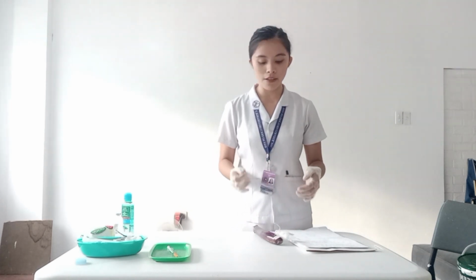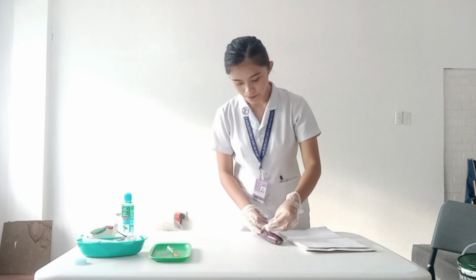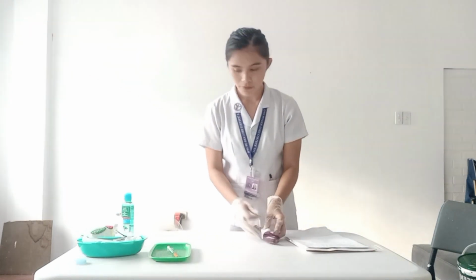So now apply gentle pressure at the site with a dry cotton ball. The use of alcohol swabs may cause pain or burning sensation. So now do not massage the area at the site of the injection because it may result in irritation, and if bleeding occurs, apply pressure with a dry sterile gauze until it stops.